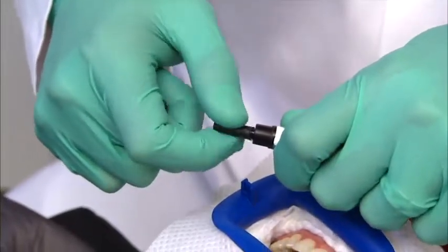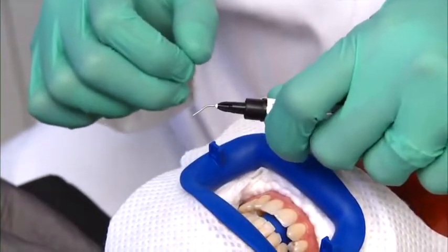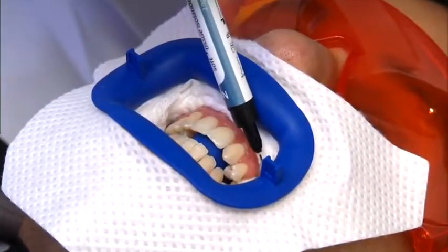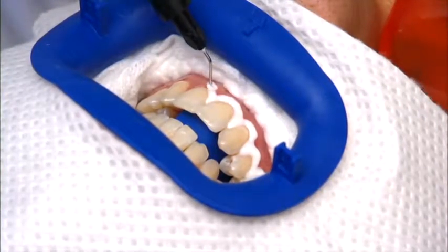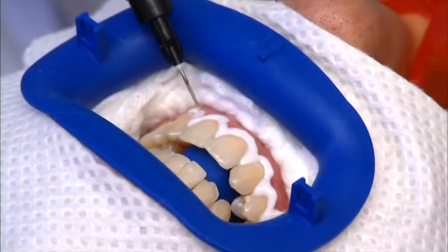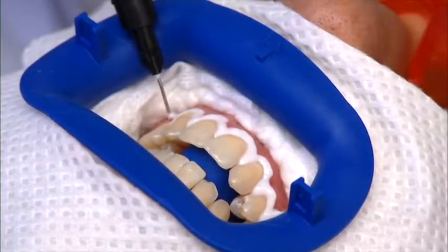Twist to remove the cap and attach the metal tip, making sure it is secure and locked into place. Dry the soft tissue and begin by scalloping barrier material to the CEJ area on the upper teeth, slightly overlapping enamel and interproximal spaces to form an enamel seal. This overlap will not affect results as hydrogen peroxide penetrates the entire tooth, including the root.